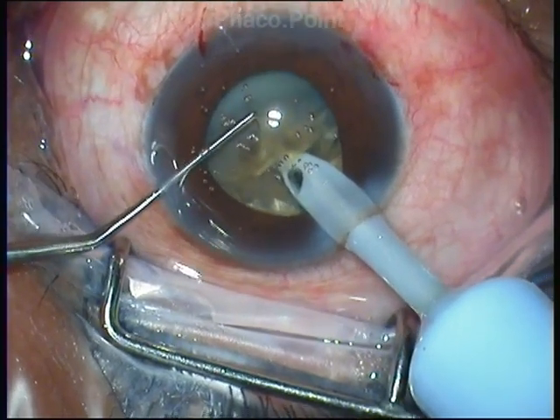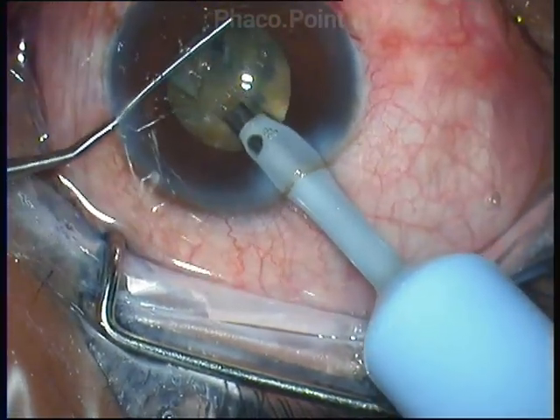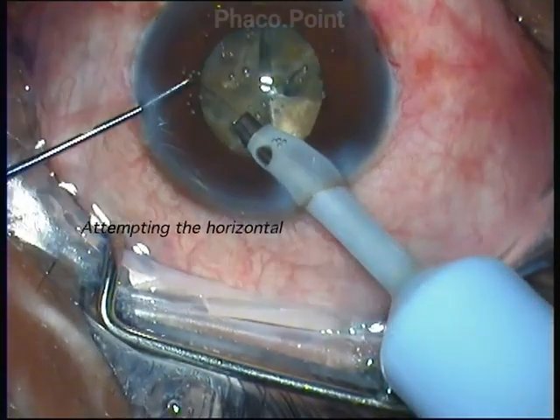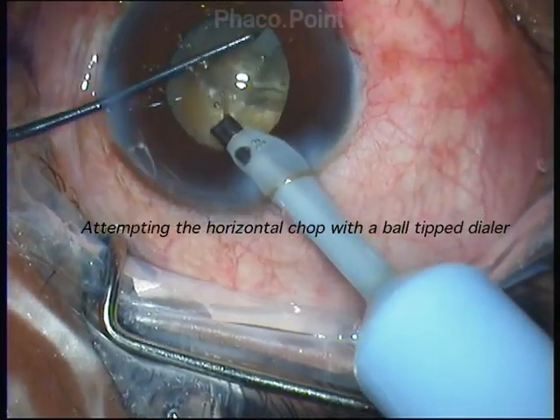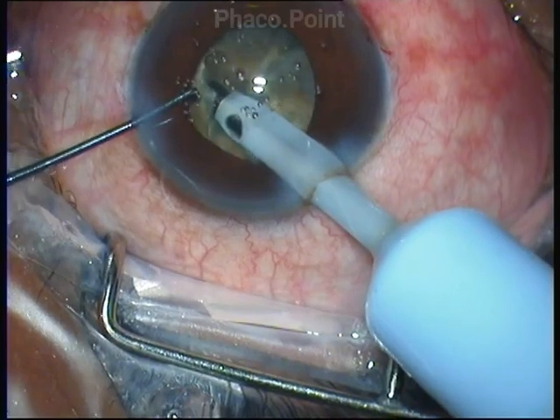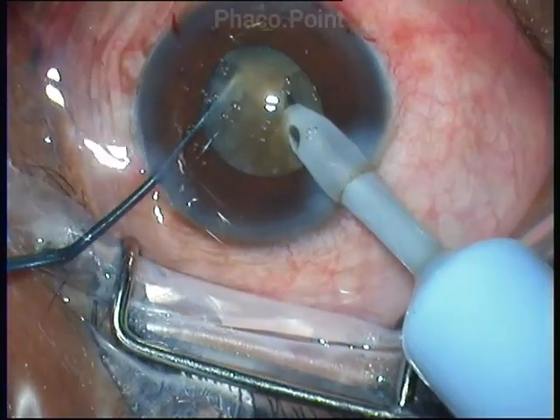So I decided to attempt a horizontal chop and see if it is any easier. I have not performed the horizontal chop in more than 2 decades, ever since I became comfortable using the direct phaco chop maneuver. I use a ball tip dialer. I go to the periphery and I find that I have to use considerably less force in order to crack this nucleus.